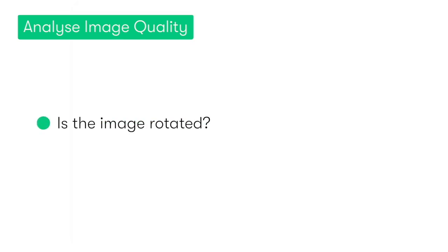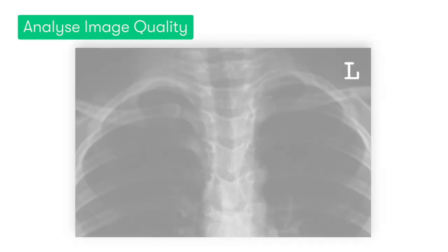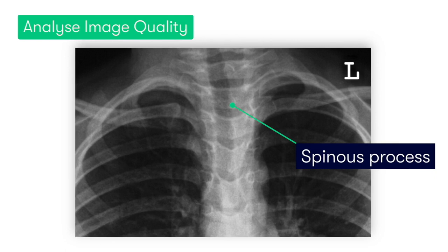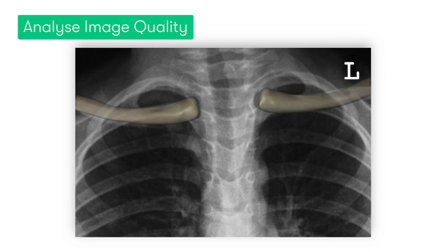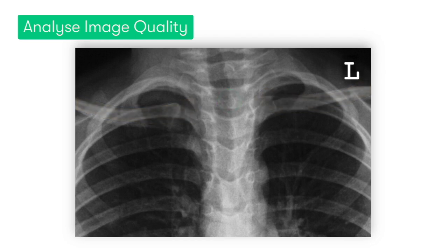We next want to check to see if the X-ray is rotated. To do this, we identify the spinous processes of the vertebrae and also the two heads of the clavicles. In a non-rotated chest X-ray, the spinous processes should sit neatly between the two clavicular heads. And here we can see that this is the case in our image, so we can say that our image isn't rotated.